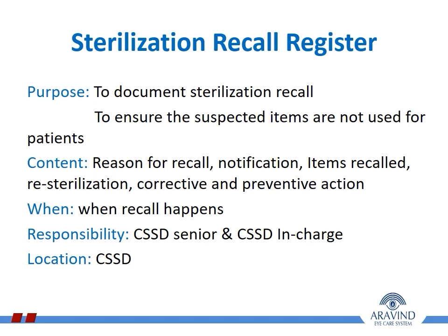Sterilization recall register. The purpose is to document sterilization recall to ensure the suspected items are not used for patients.